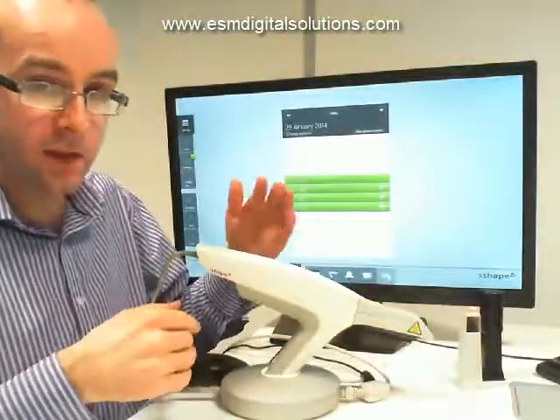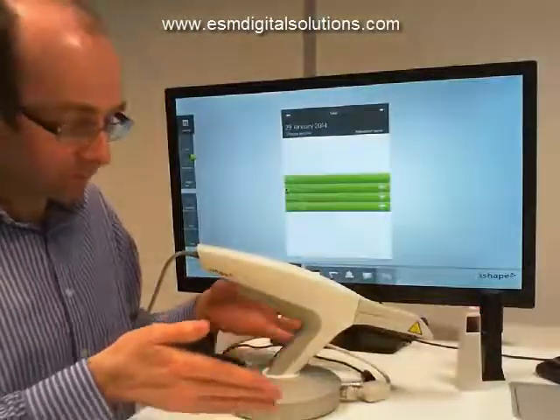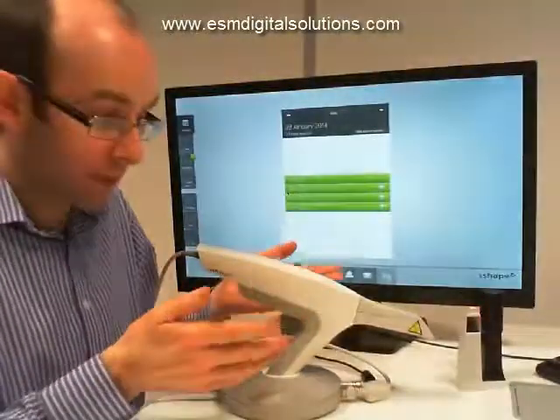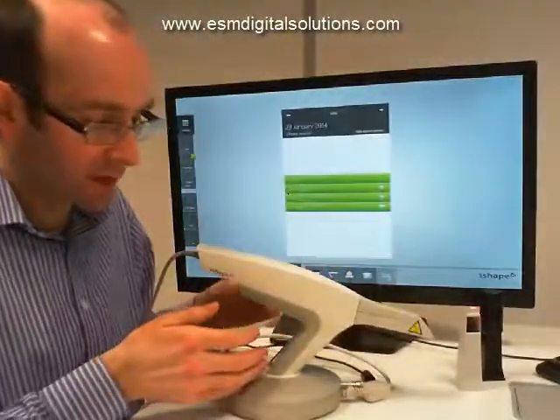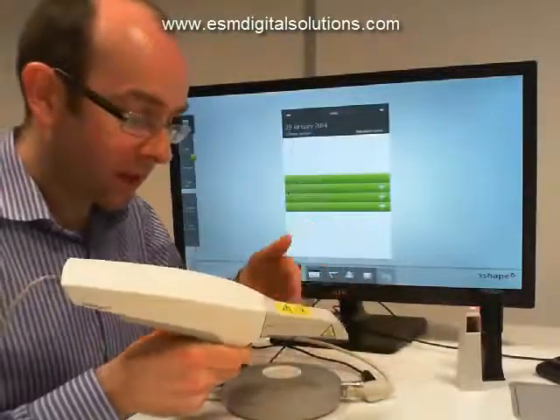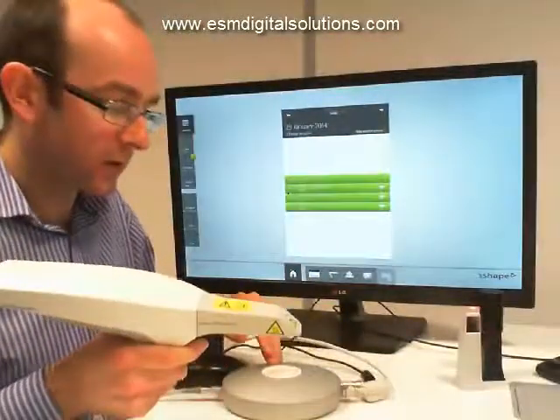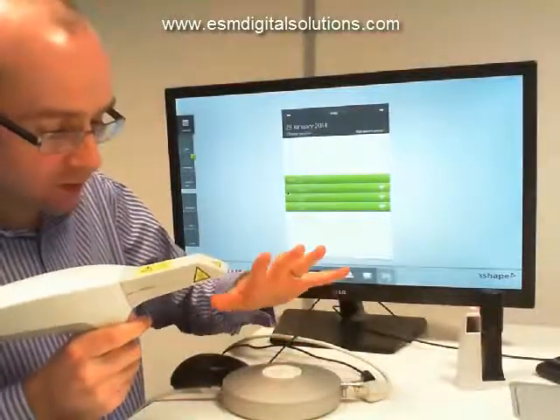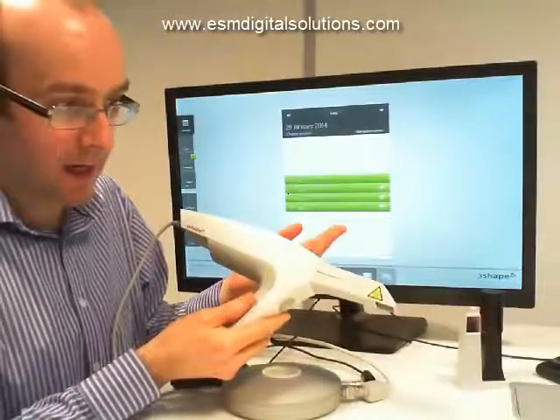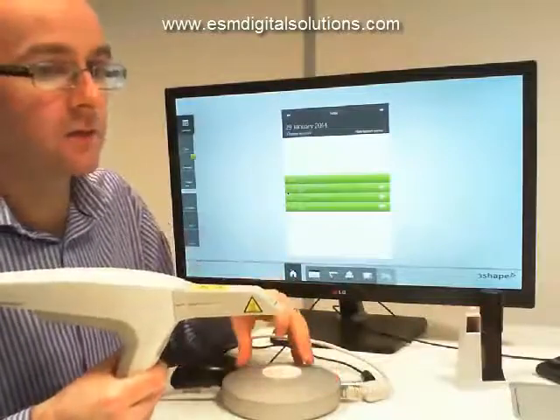TRIOS cart is a standalone unit with a touch screen monitor and PC built into the unit. TRIOS pod is a lot more portable — it's the pod, scanner, and laptop all working together, or we can connect it through to a PC. It's quite portable and maneuverable within the office or clinic or surgery, and if you move from one location to another you can do so with ease. The main components are the scanner itself — sometimes referred to as the wand — and the base unit, referred to as the pod.